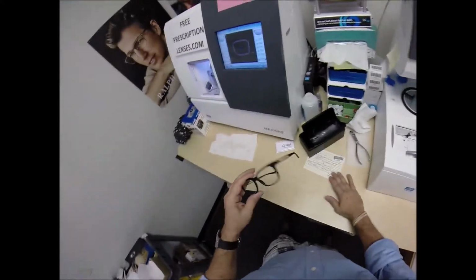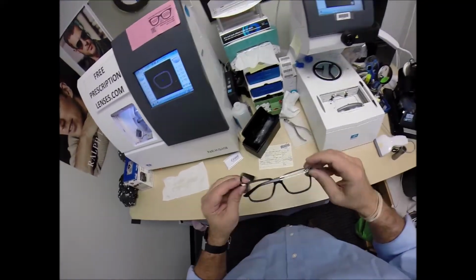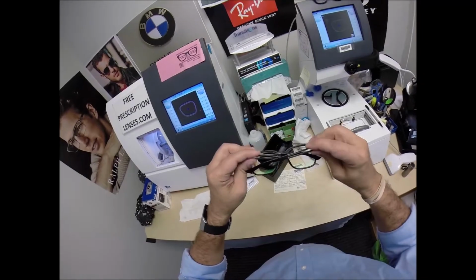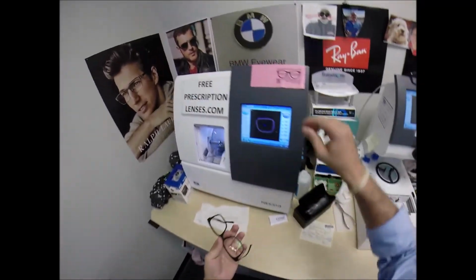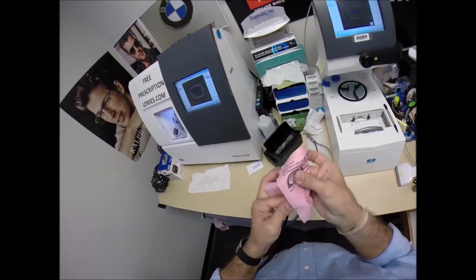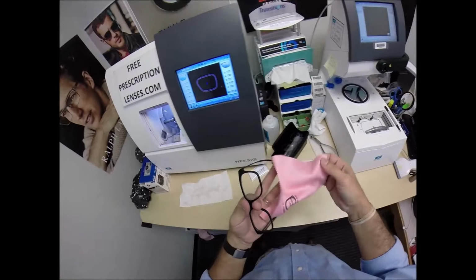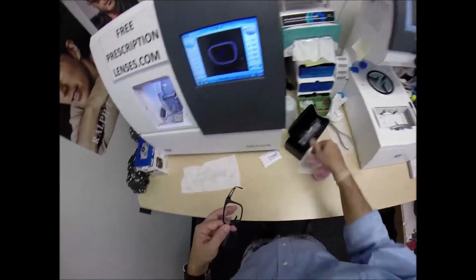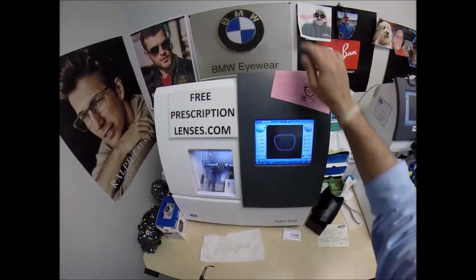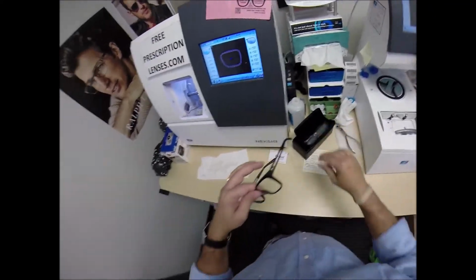So, let's flip this over, make sure there is no wobble. There is none. I close each temple to make sure they overlap perfectly, and they do, that neither temple is askew. Now, Karen, I send out a selfie request in every package to have your picture on the website. I would love to have a picture of you rocking these. I also send out cleaning instructions, not only for your Versace cleaning cloth and your Crizal cleaning cloth, but the premium microfiber cloth that I will provide. So they will last you for years, as well as your cases too.